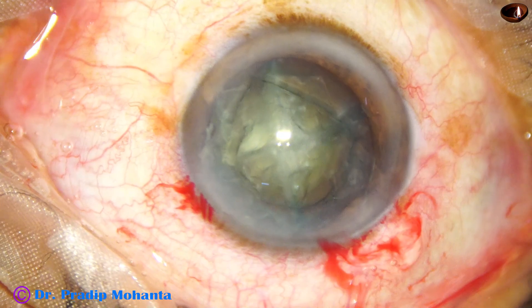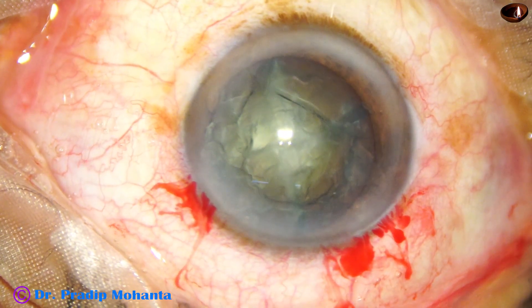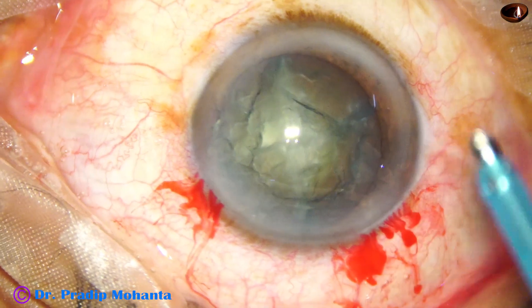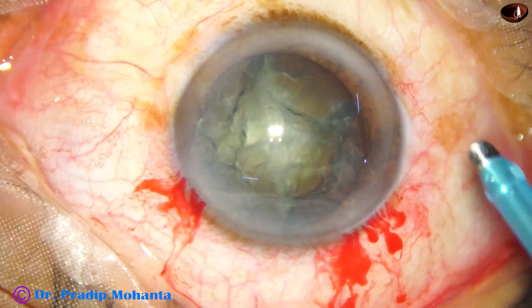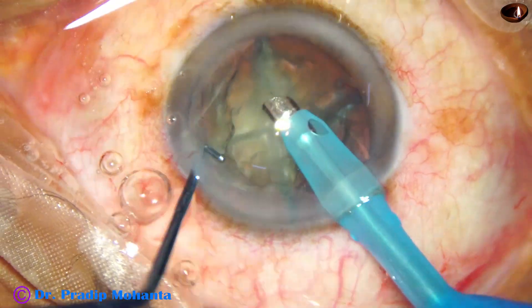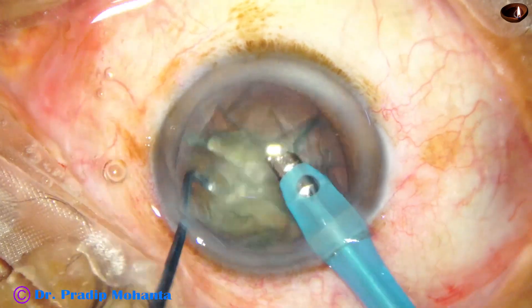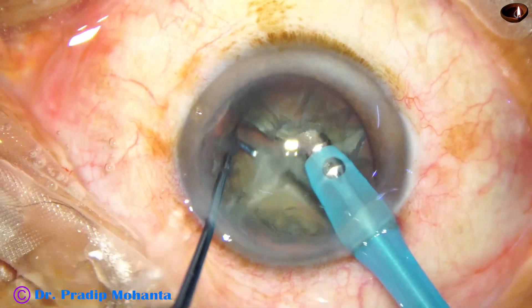If we do this with any other technique it is going to take longer. Please don't try this prechaopper in harder cataracts — try it first in grade 2, grade 2 plus, maximum up to grade 3. Don't go beyond grade 3 or you may be frustrated.